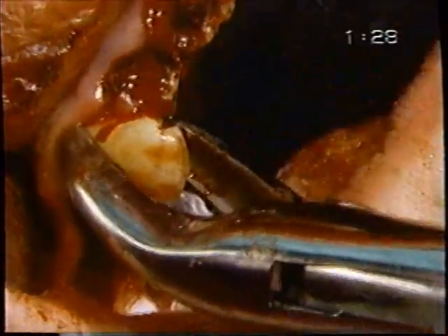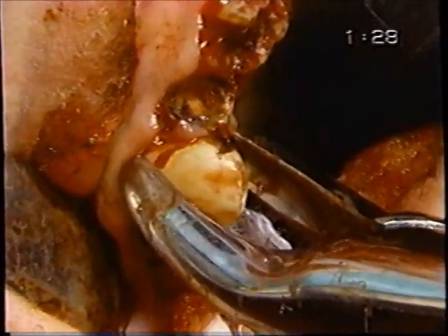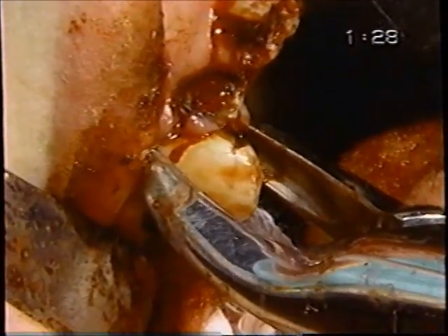Very difficult to luxate in this situation because of the way that the teeth are broken down. Some people would say it's because that lateral is still there that it helped maintain strength of bone, so we didn't lose it right there.